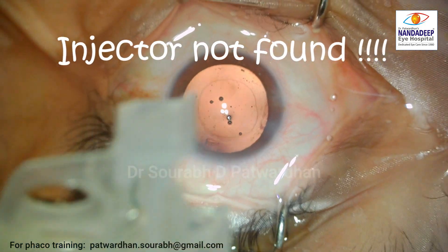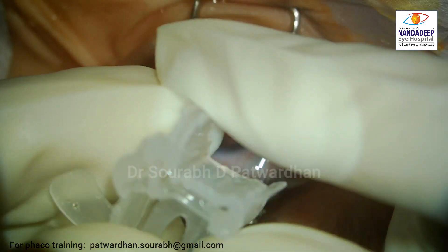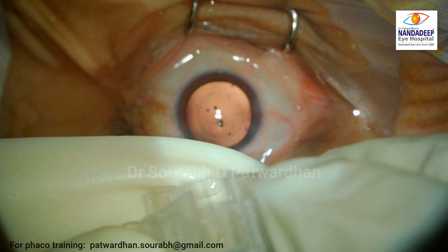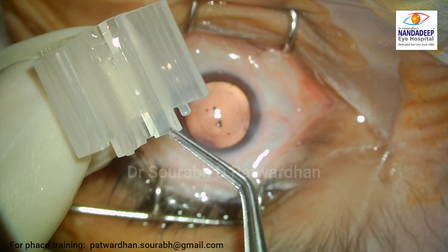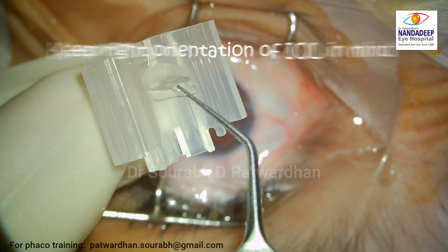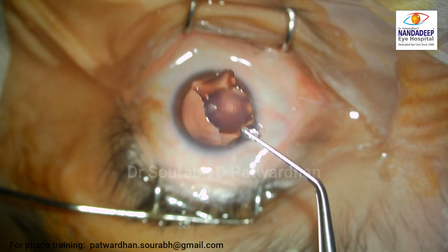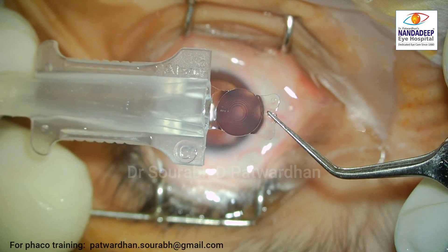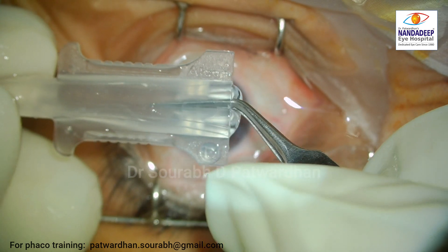When it comes to IOL insertion, my assistant announced that he could not find the right injector that comes with the IOL. This is a semi-preloaded IOL — I just have to insert the cartridge into the injector and inject. But now I have to open it and make sure the orientation of the IOL is correct. The trailing haptic and the leading haptic holes have to be properly seen. My assistant has given me a different cartridge — this is a C cartridge of ALCON which we generally use for hydrophobic IOL.